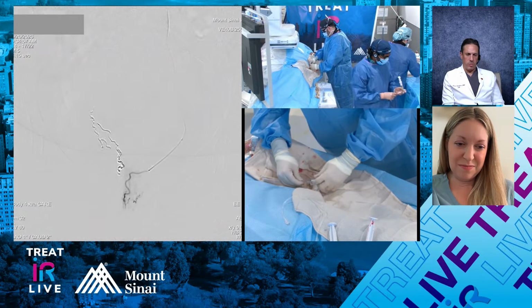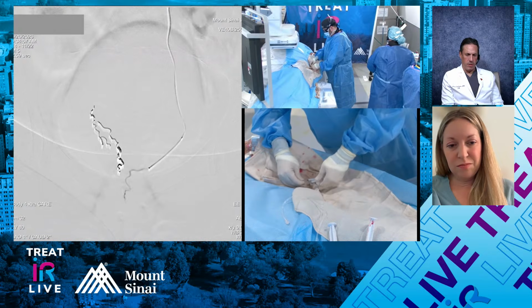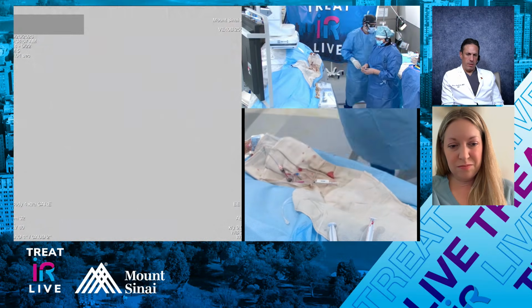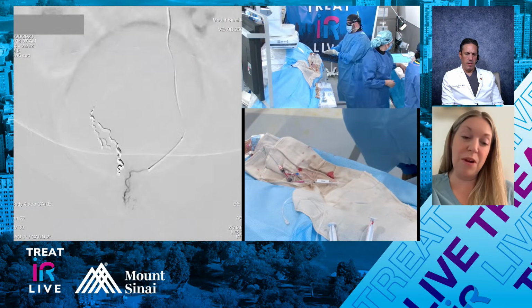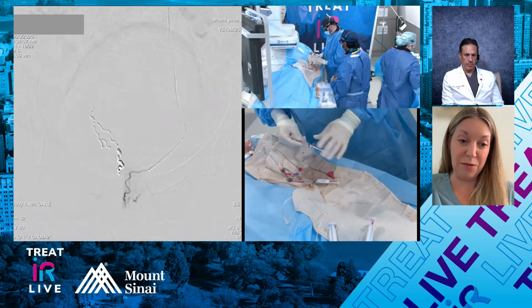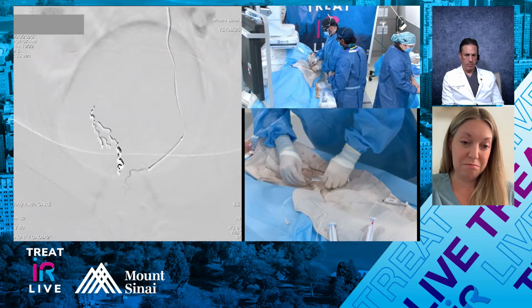And you guys, is the cc diluted nine to one, those 100 particles? Wow, there's a middle rectal there too. Yeah, 20, and then we'll do a cc. Or I think it could handle it. I'm usually just starting with a smaller amount, especially given the small vessel. Do you do aliquots? I do.